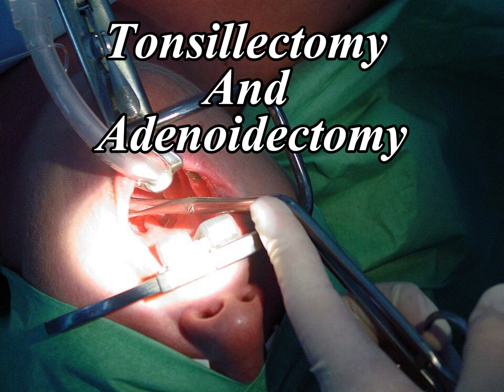Patient positioning and exposure. The patient is placed supine under general anesthesia with endotracheal intubation. A McIver or Crow-Davis mouth gag is inserted and suspended to expose the oropharynx and hold the mouth open. The tonsils are visualized in the tonsillar fossa, located between the anterior and posterior pillars. A nasopharyngeal mirror or endoscope may be used later to view the adenoids. Pearl. Proper mouth gag positioning avoids tongue compression and helps reduce venous congestion and bleeding during dissection.